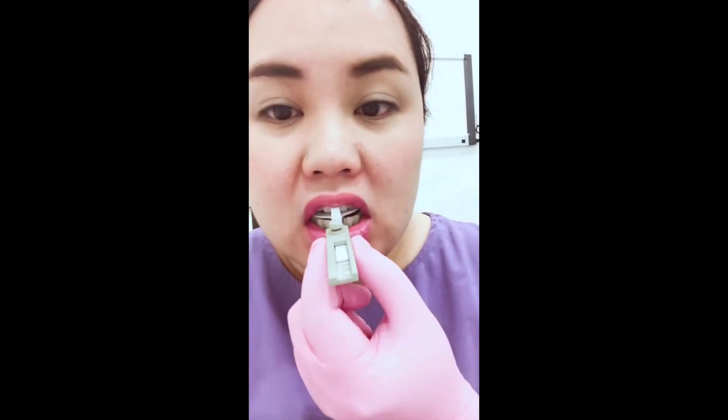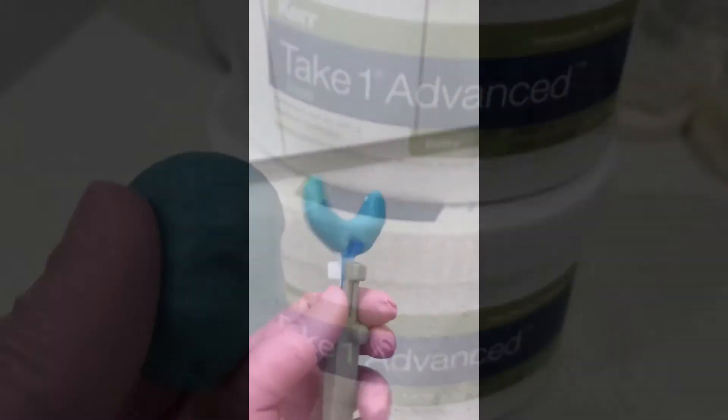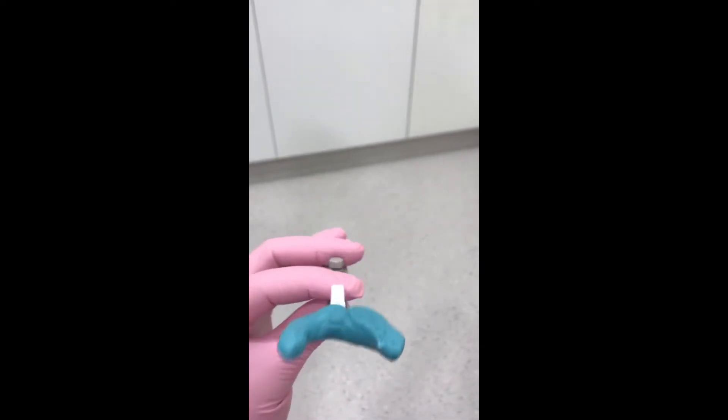When you're happy with that position, you can proceed to take the bite record. Here I am using some putty. Full occlusal coverage is essential — make sure that you don't cover the blue portion, which is the lower incisor clamp.